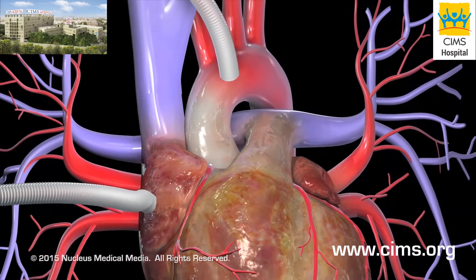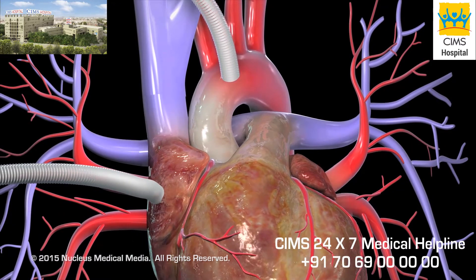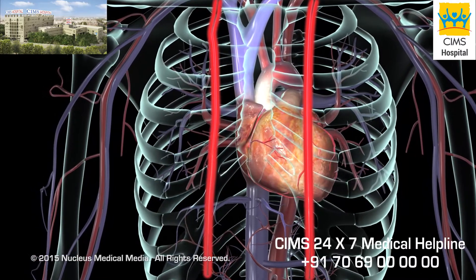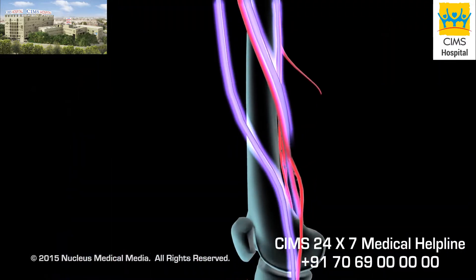Your circulatory system will be connected to a cardiopulmonary bypass pump or heart-lung machine. This machine temporarily performs the functions of your heart and lungs during the surgery, allowing your heart to be stopped while the surgeon sews the grafts into place. One of two blood vessels is typically used for the grafts: the internal thoracic artery in the chest or the saphenous vein in the leg.